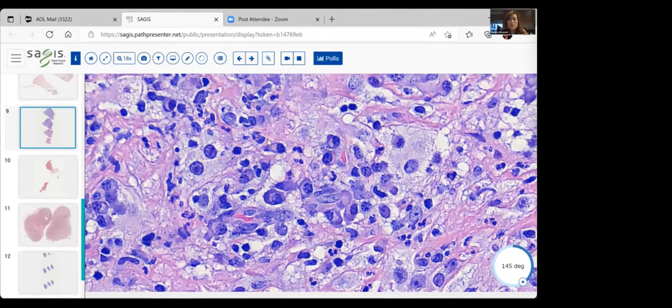And everybody should hopefully recognize this is a plasma cell. Plasma cells have eccentric nuclei, sometimes a little clock-faced nucleus with little collections of chromatin pattern along the edges. A condition like this, which has large skin nodules with foam cells and lots of these plasma cells, is characteristic of the condition called Rosai-Dorfman. They sometimes on exams will show you a close-up like this. They'll say, patient presented with large nodules and massive lymphadenopathy, and this is the pathology. You see foam cells, you see plasma cells.